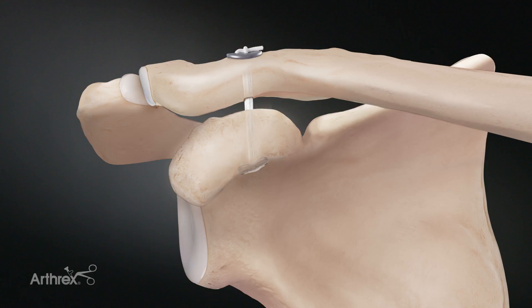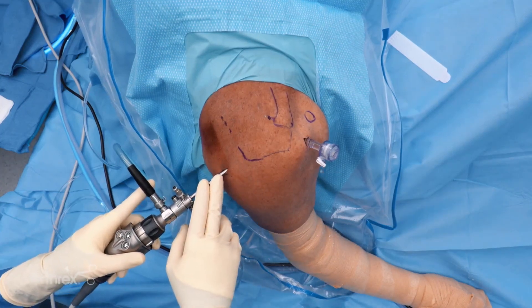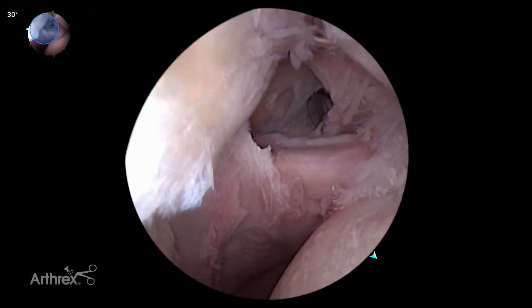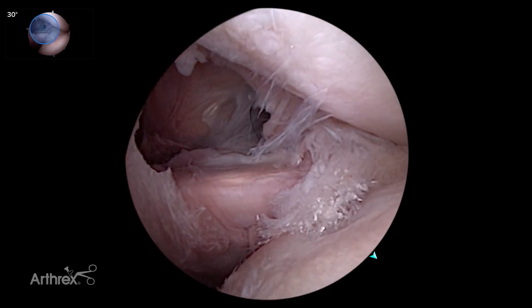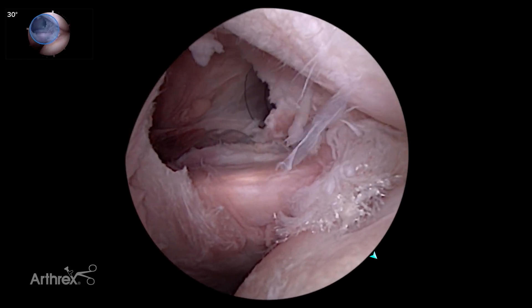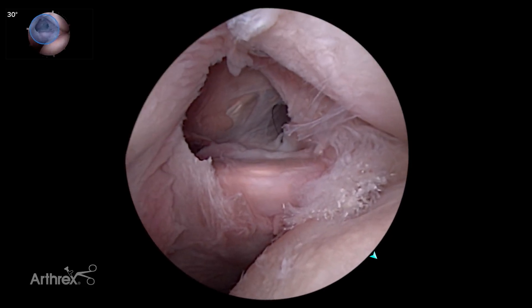Today we'll be demonstrating a knotless arthroscopic stabilization for AC joint separations using the knotless AC tightrope. We have a right shoulder with our standard posterior viewing portal. We've already established the cannula for the scope and our anterior lateral portal. We started cleaning out some of the rotator interval tissue, which is an important first step when approaching the coracoid.